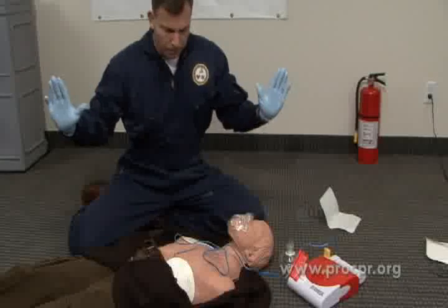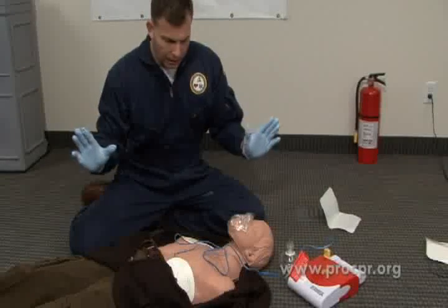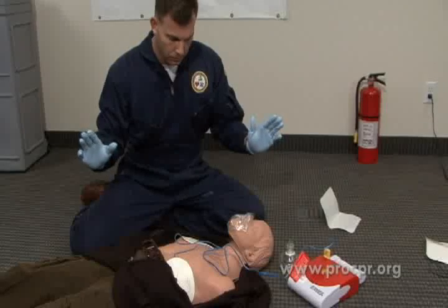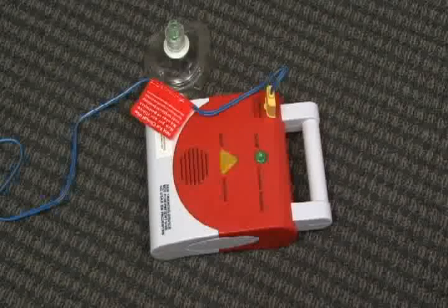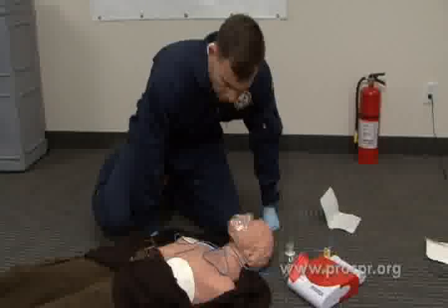Analyzing rhythm. Everyone stand clear. Do not touch the patient while we're analyzing. Shock advised. Charging. Everyone stand clear. Another check to make sure no one's touching the patient. Everyone stand clear. Push the shock button. Shock delivered. Begin 5 cycles of CPR.